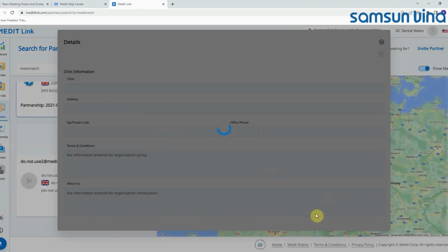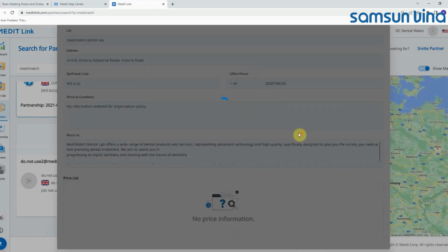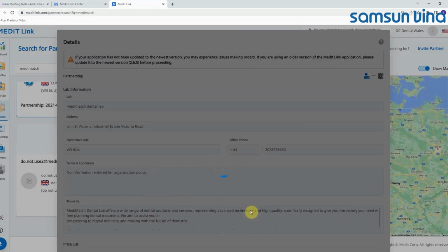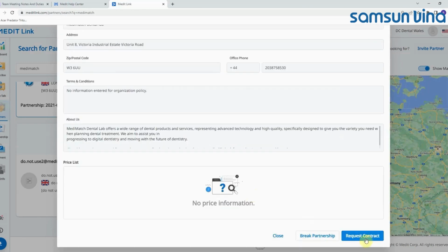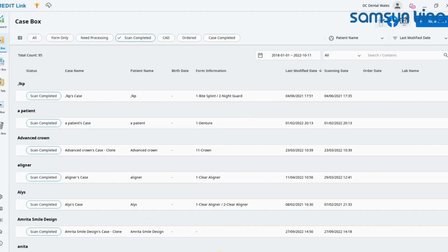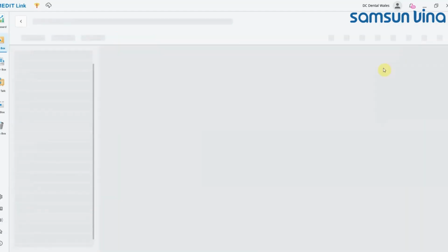and then once it loads, down in the bottom right there will be a request partnership icon, and you just click the icon and it will send them a link. And here we go, request. Oh, I'm already partnered with them, obviously, so it would say request partnership here. You just click request partnership and they'll be able to accept the invite, and then you'll be paired. And then when you hit the order button in Medit Link, they will be in the drop down list.